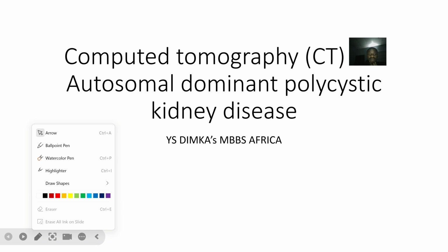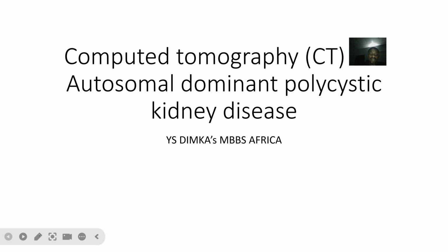Now we're talking about diagnosing polycystic kidney disease, and we spoke about all the modalities. So we listed imaging as one of the top ways of diagnosing polycystic kidney disease. One of the imaging modalities we can use is a CT scan, also known as computed tomography.